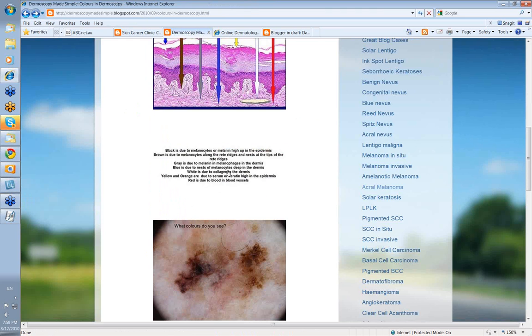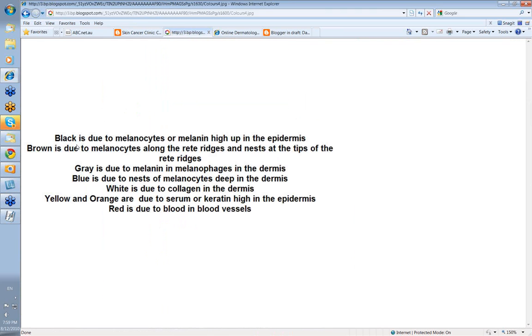Let's go over that once more. Black is due to melanocytes or melanin high up in the epidermis. Brown is due to melanocytes along the rete ridges and the nests at the tips of the rete ridges. Grey is due to melanin and melanophages in the dermis. Blue is nests of melanocytes deep in the dermis. White is collagen in the dermis or sometimes retained keratin high up in the epidermis and milia cysts. Yellow is usually due to serum or keratin high in the epidermis. And red is the color of blood and blood vessels.